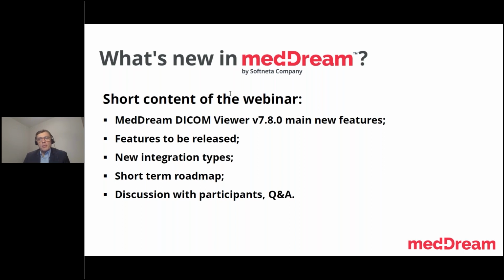Today I will split my presentation in two parts. One part will be the presentation, where I describe the features and you will see some screenshots. Later on I will try to show you a live presentation of the most important features and solutions which I believe you need to take a look at and double check, because this opens new possibilities for you.